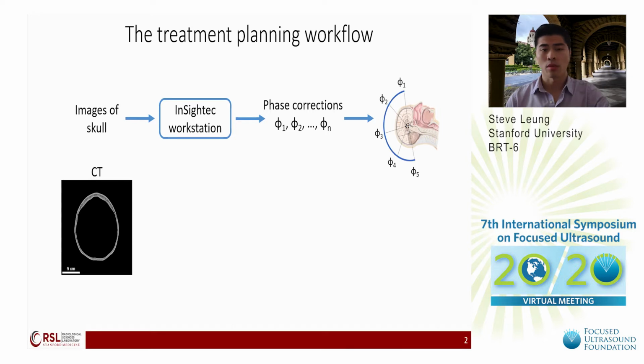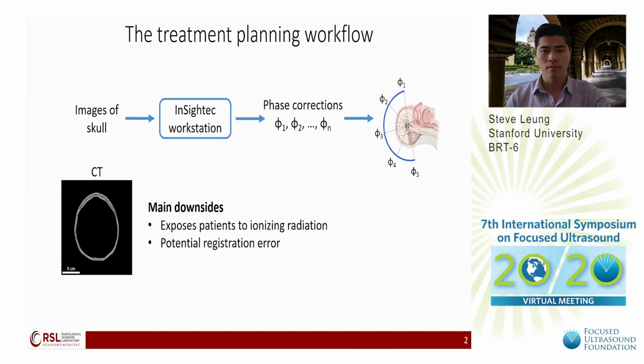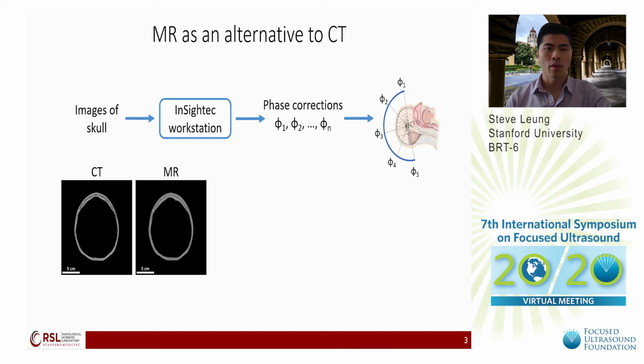CT images are typically used. However, there are some downsides to the use of CT. One, it exposes patients to ionizing radiation. And two, errors can arise from registering the preoperative CT to the intraoperative MR. For some years now, MR has been proposed as an alternative to CT to overcome some of these downsides.